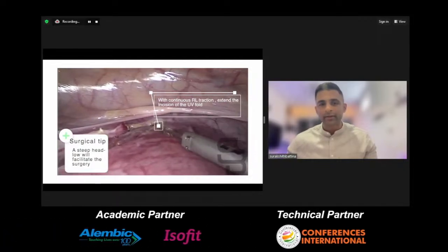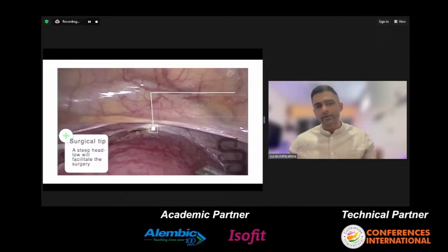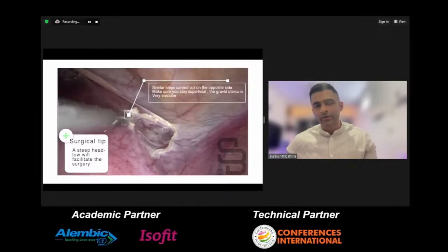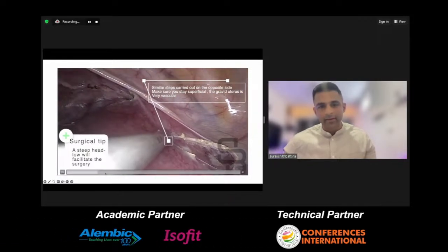One more thing I understood is that whenever you're doing anything on the left side, you try to get the table tilted towards the opposite side. That way the uterus also moves along with it, and gravity plays its part, and it will help you perform the procedure much more efficiently.